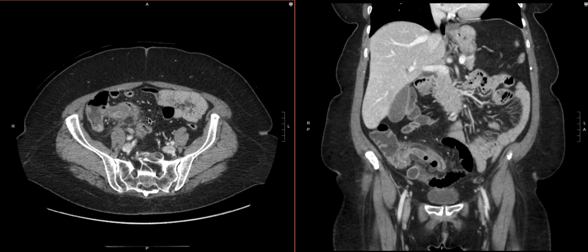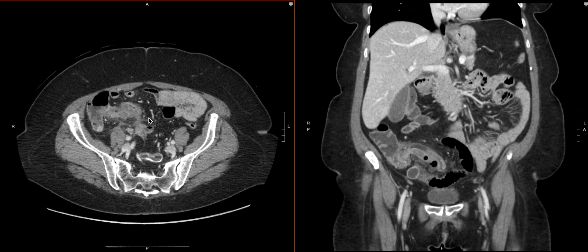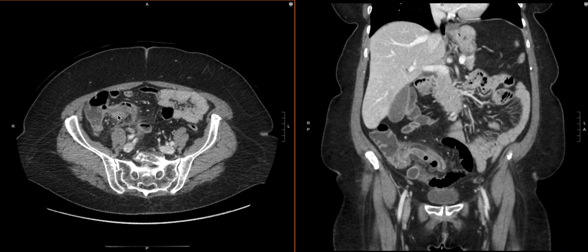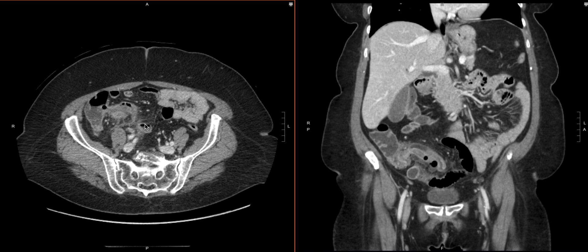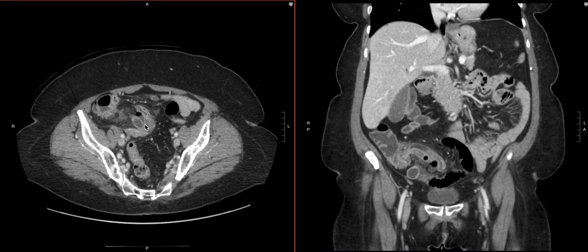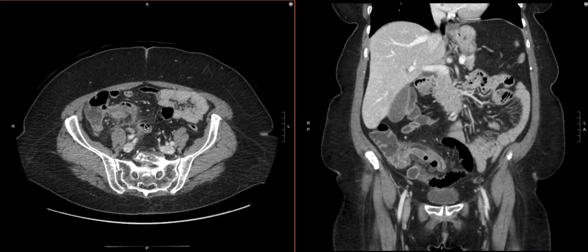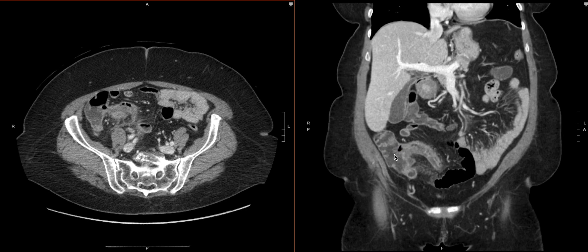This case will show why — because oftentimes the appendix and terminal ileum can look similar and even be in a similar location. As we're looking, we have two tubular structures. If we follow this one, this is actually the terminal ileum, which comes back to this small bowel loop here. They're both actually a little inflamed, but it's because of the appendicitis. Long story short, this is the terminal ileum plugging into the cecum, and we can kind of see the ileocecal valve here.